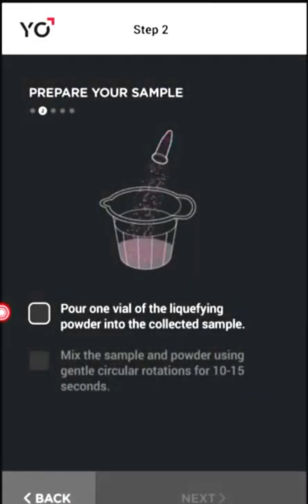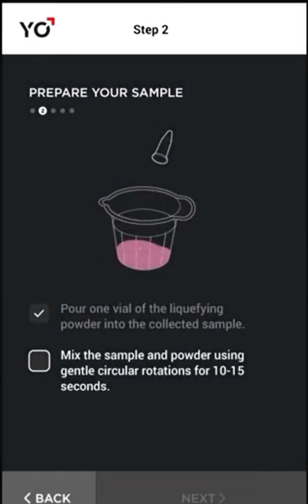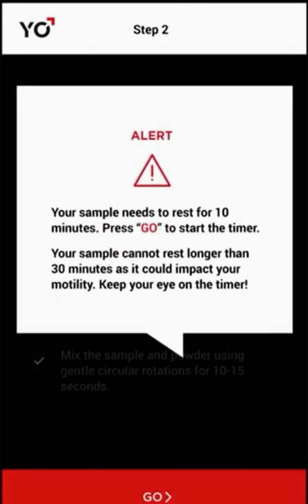Prepare your sample by pouring the liquefying powder into your sample and mix it up as instructed. Your sperm needs to rest for 10 minutes. Tap go to start the timer.